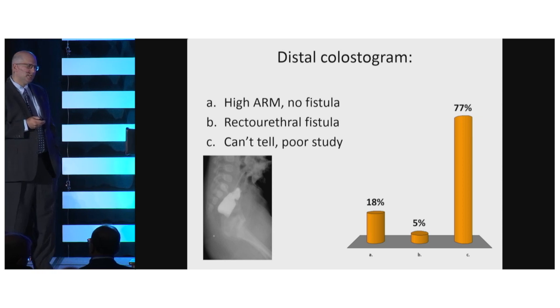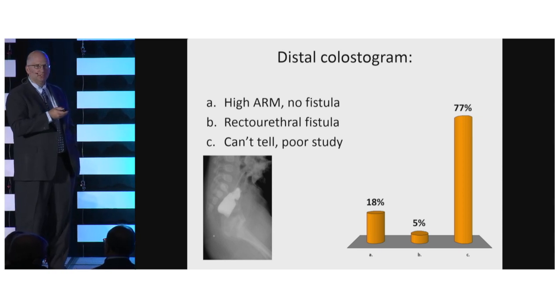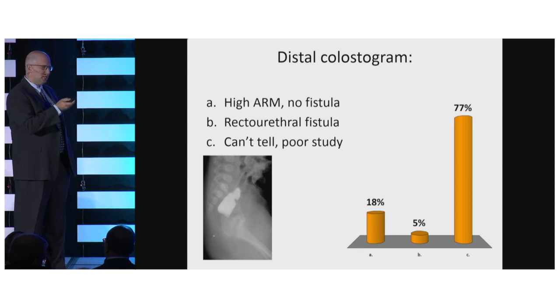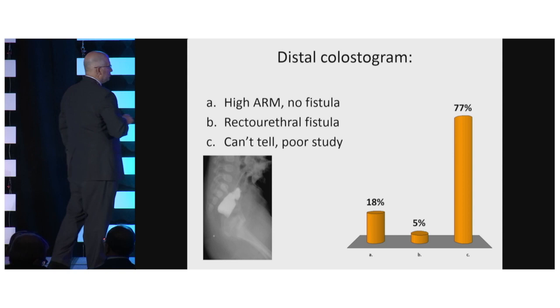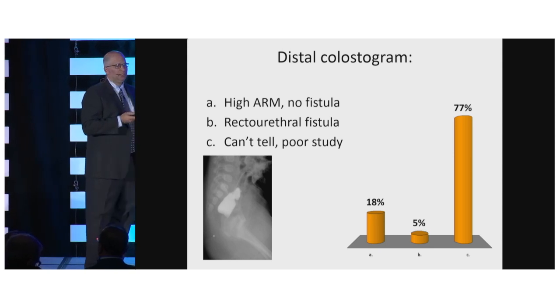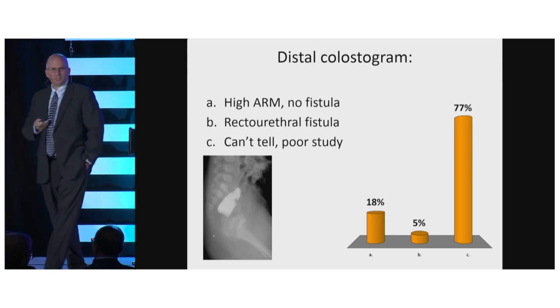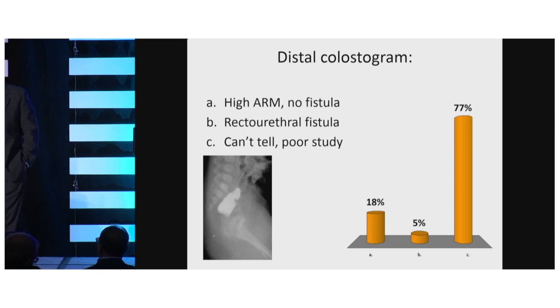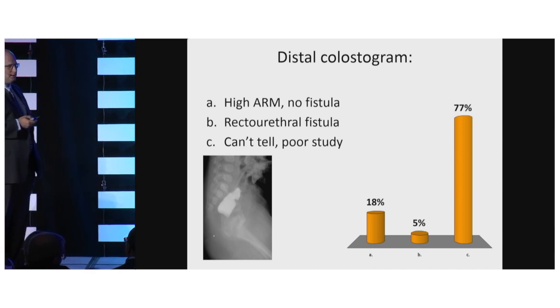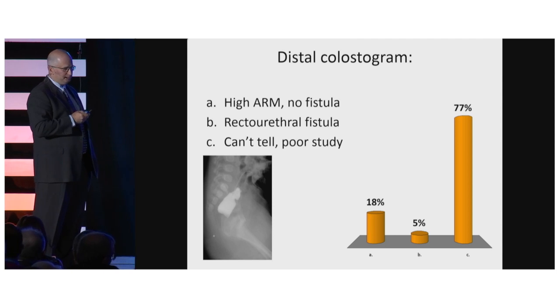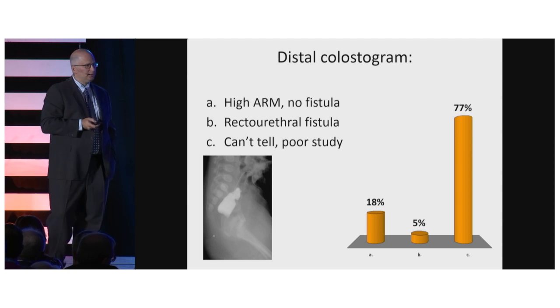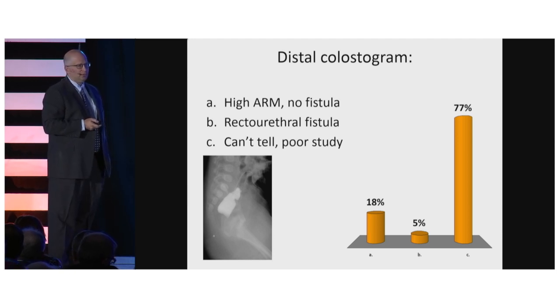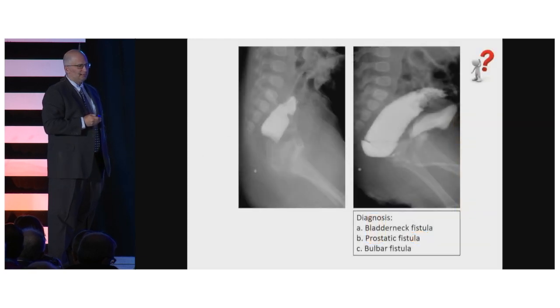What's important to recognize is you'll never find a rectum that at the bottom is flat. It's flat because of the PC line - the pubococcygeal line - where the sphincters compress the rectum inside the pelvis. This distal colostogram has not been given enough pressure, so if you were to approach this rectum you won't know exactly where the distal rectum is.